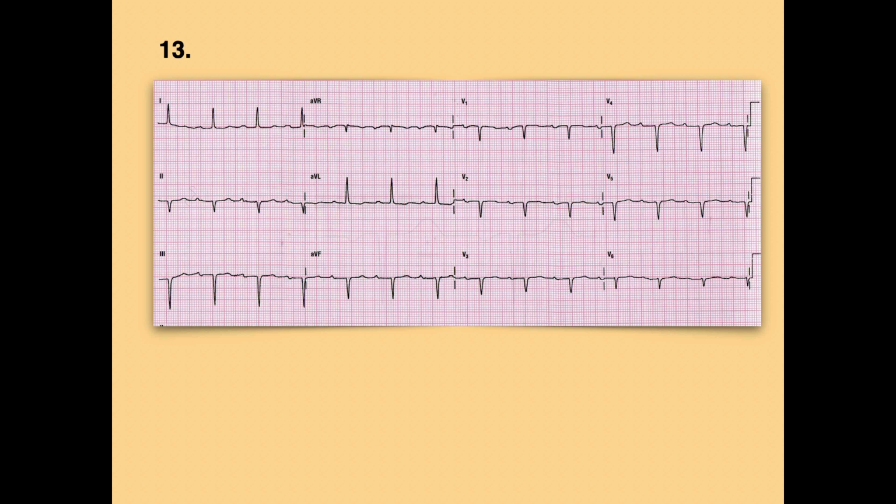I'm gonna say yes as well. Okay, we're not worried about AVR. What about AVL? No. Okay, what about AVF? Yes. Okay, V1? Yeah. V2? Yes. Yeah, so this whole section, as you said, V1 through V6.